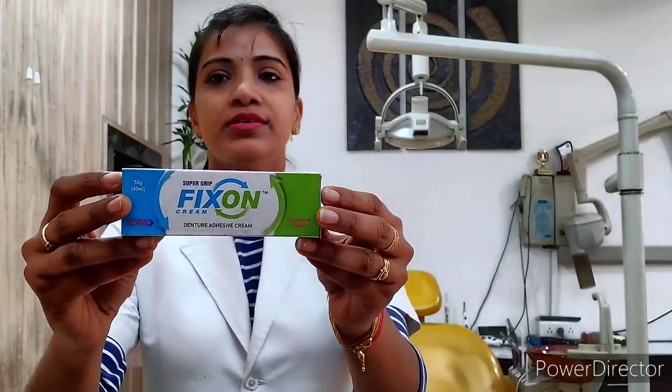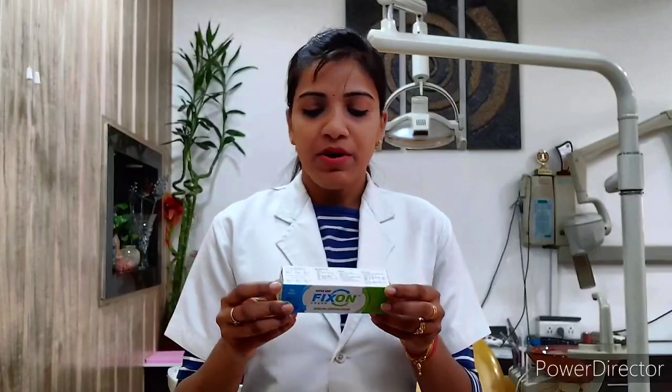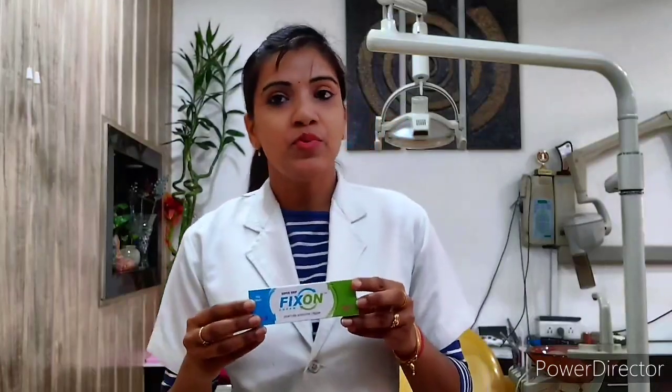So one of our products is this — Super Grip Fix On Cream. I will tell you about this cream. It is a very good product. You apply it and then put the denture in your mouth, and it will work very well. This is also available in the market in powder and cream form.